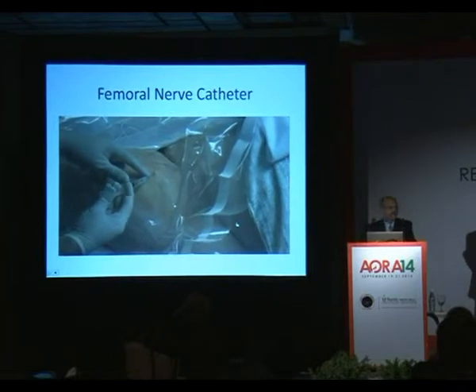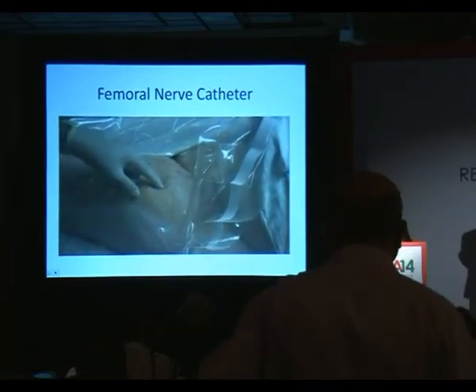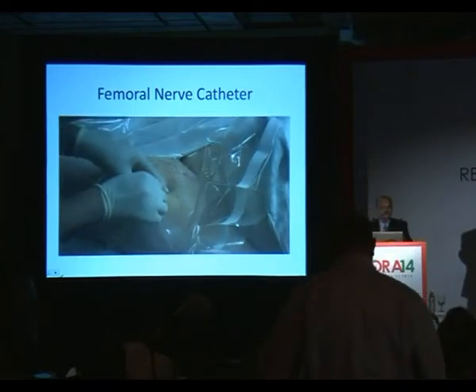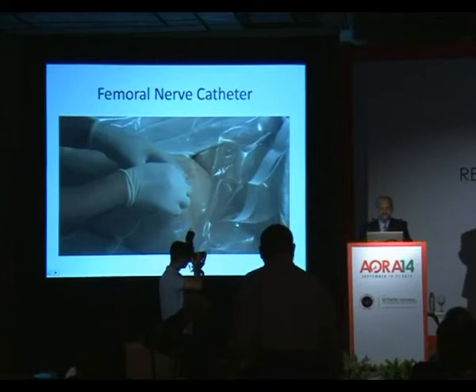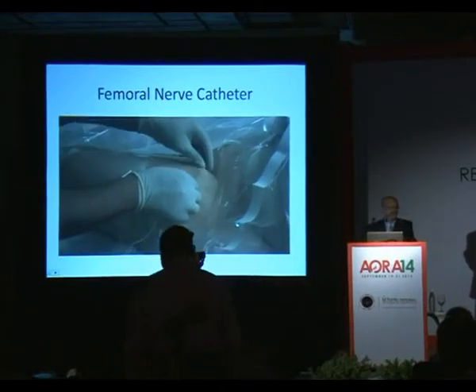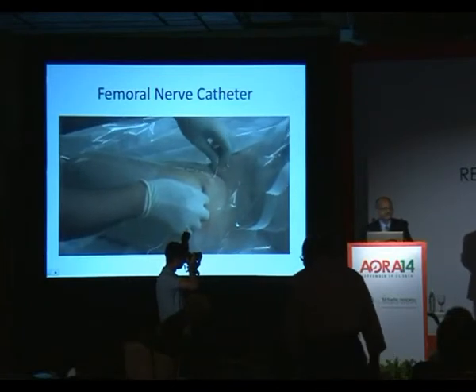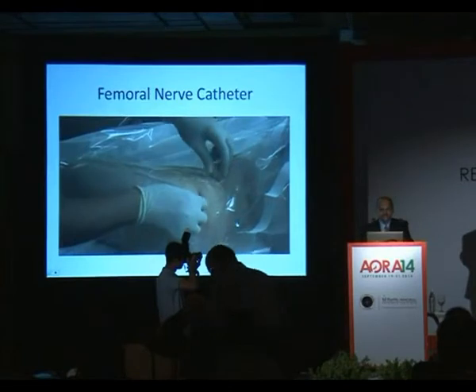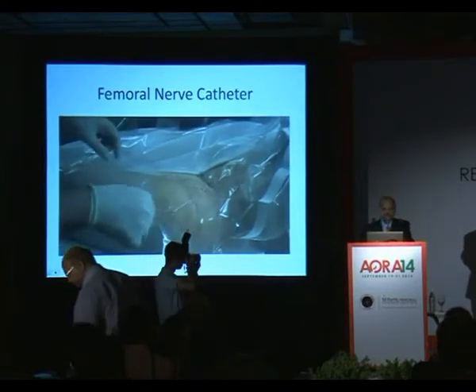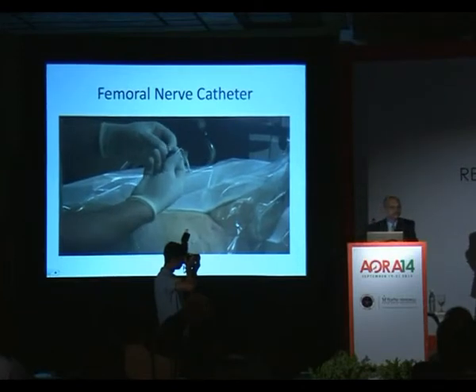Again, we tunnel the catheter. A lot of it is going to be repetition, but I think it's important for you to see these different techniques so you can use parts or all of it in your practice. Again, we tunnel all the femoral catheters. As I said, we tunnel every catheter that we place. These catheters usually stay in place for 2 to 3 days post-operatively. And sometimes patients go home with them. So you want to be very sure in how you affix them.